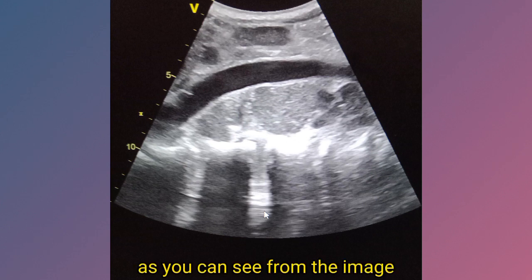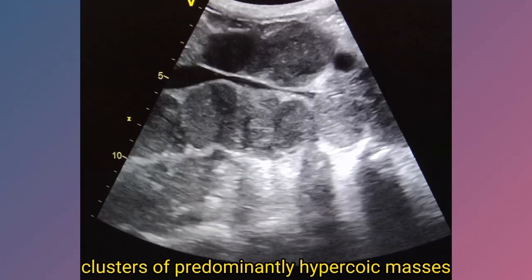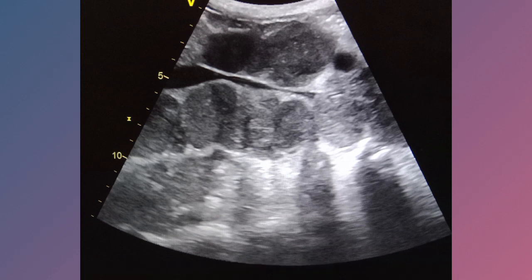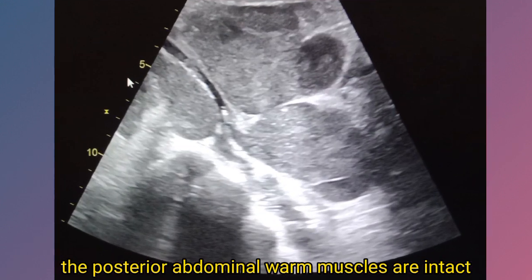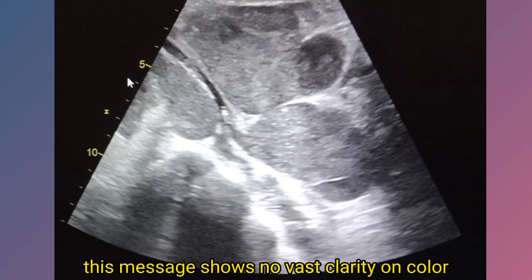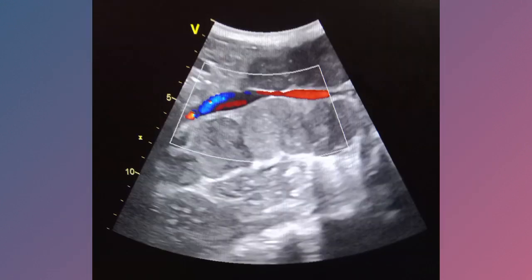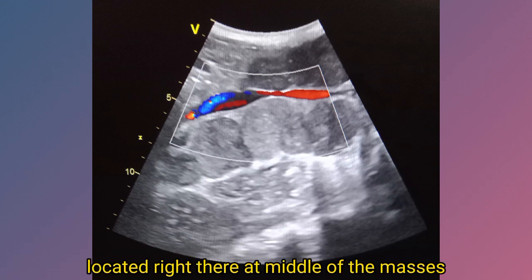As you can see from the image, clusters of predominantly hypoechoic masses are noted on each side of the abdominal aorta. These masses are non-infiltrating. The posterior abdominal wall muscles are intact. These masses show no vascularity on color Doppler assessment. And that is the abdominal aorta located right there at the middle of the masses.